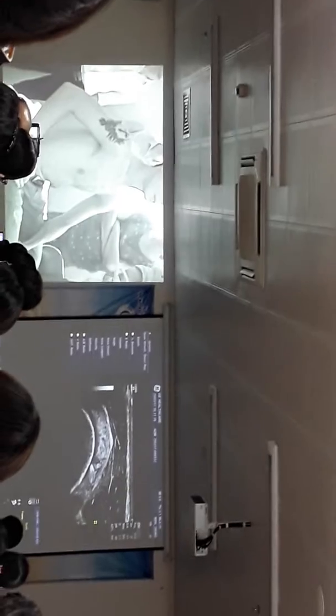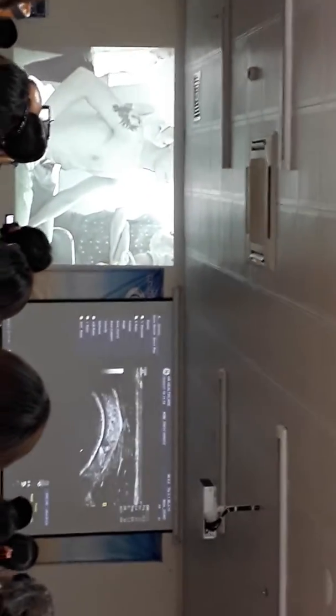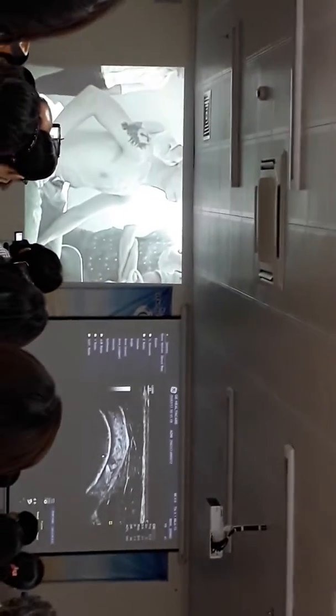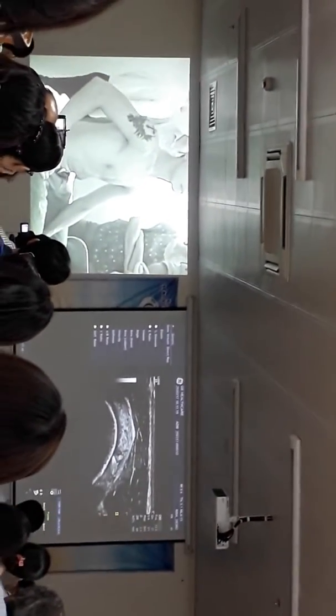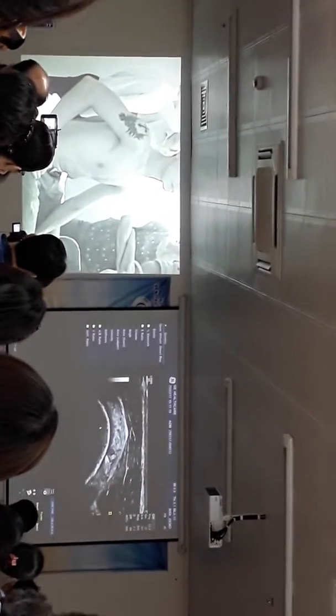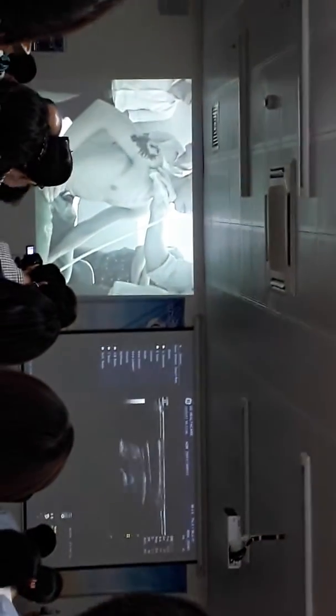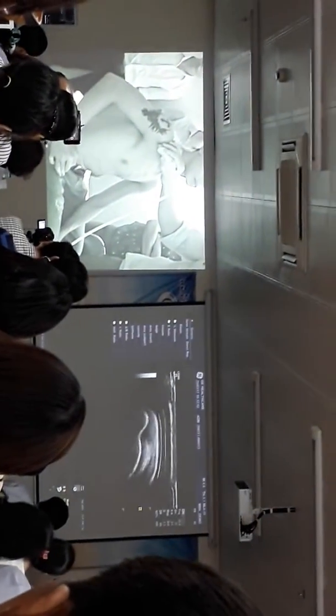So you can see that there's a little space just there, little one just there, little one there, little one there. They're just the spaces in between the individual tendon fibers, so that's normal.